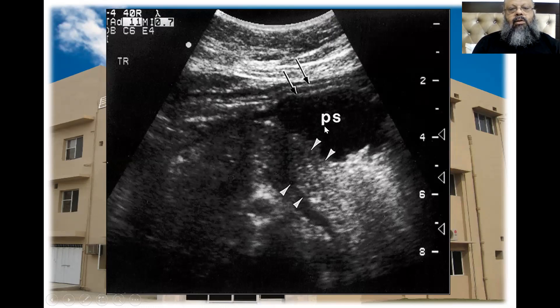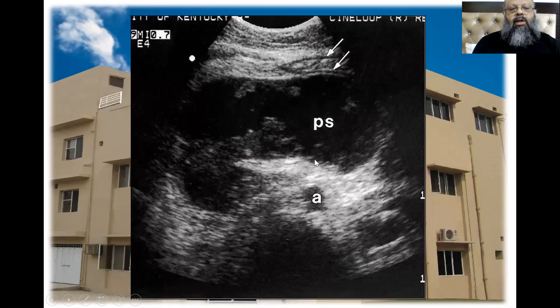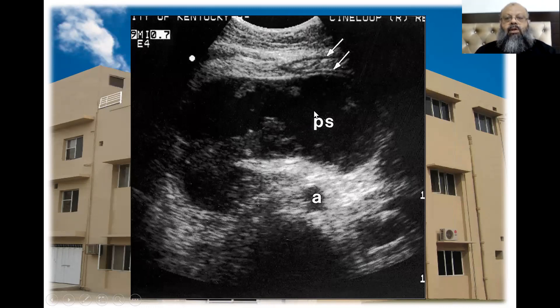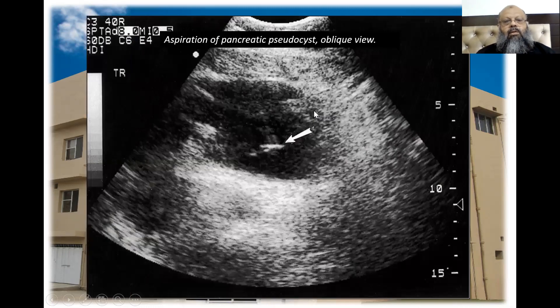This is a pseudopancreatic cyst, usually found anterior to the body of the pancreas. It seems as if it is originating from the pancreas, but it is actually a fluid collection in the lesser sac — fluid in the lesser sac, which is the pseudopancreatic cyst.